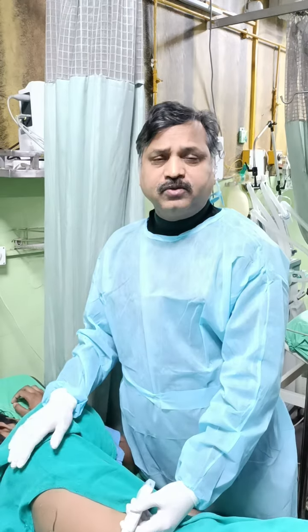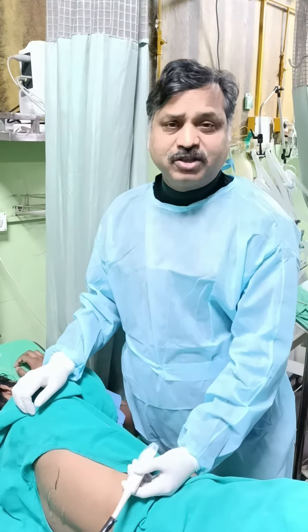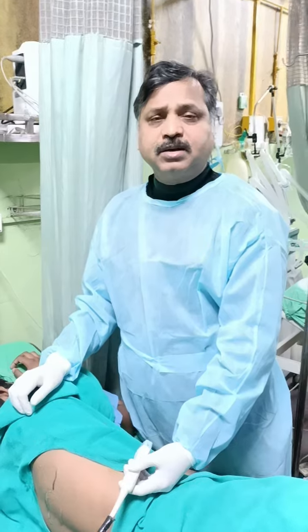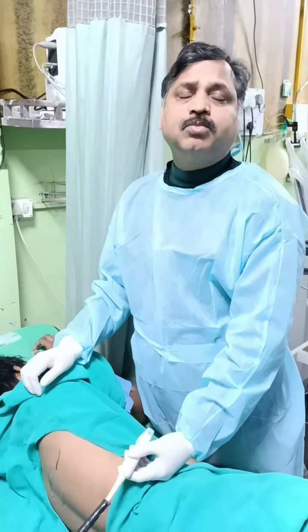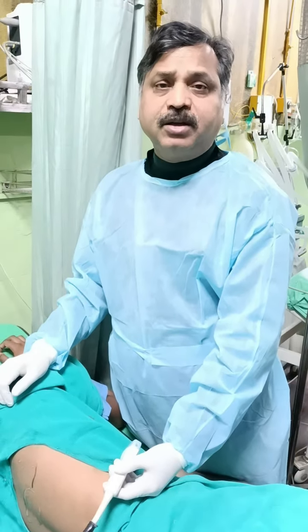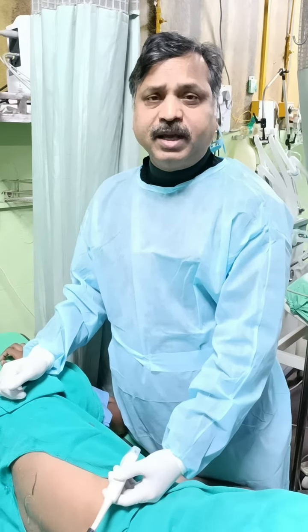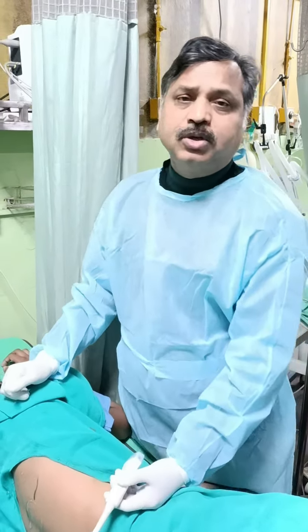This is a patient of laparoscopic cholecystectomy, and the erector spinal plane block is a very good modality for relieving postoperative analgesia nowadays in cholecystectomy and also in appendectomy.